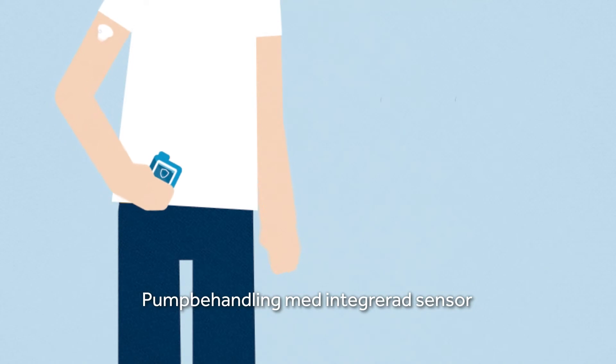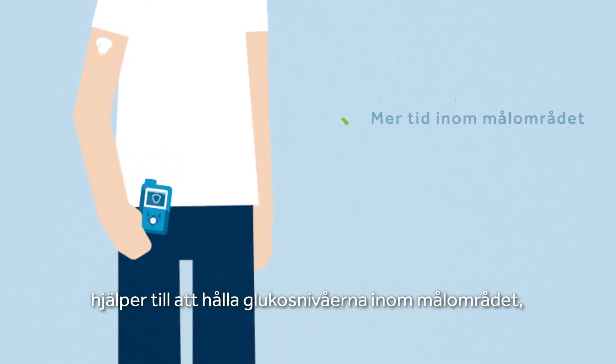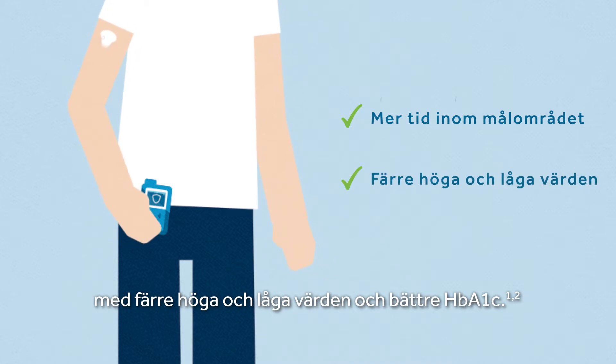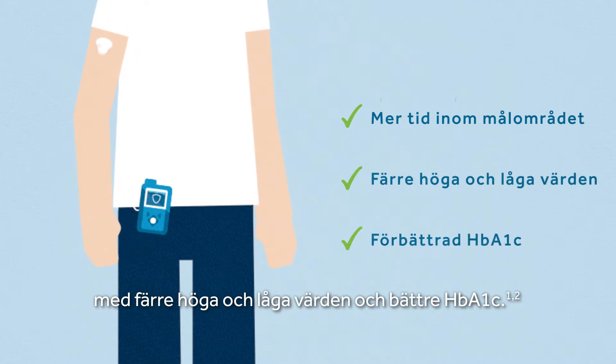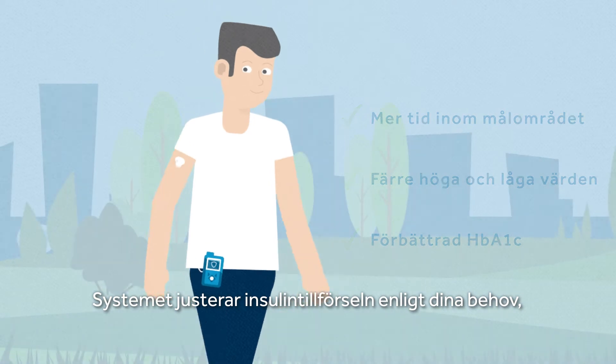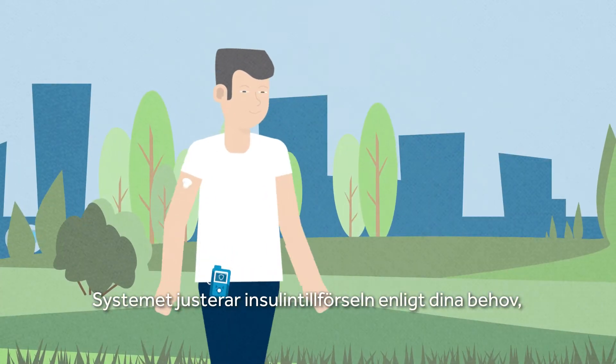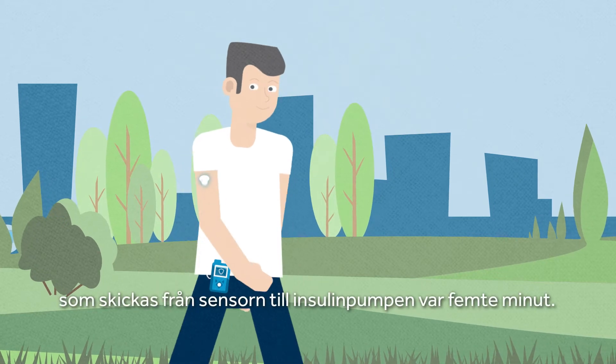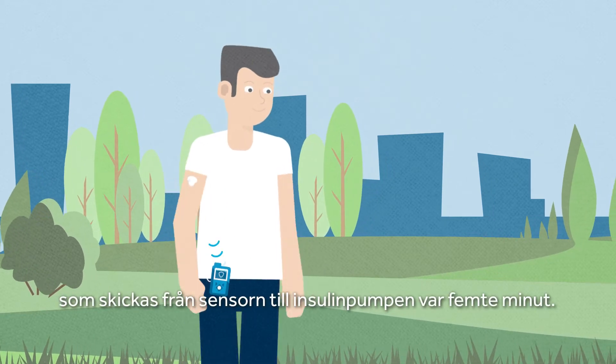Sensor Augmented Pump Therapy helps keep your glucose levels in range with fewer highs and lows and achieve better HbA1c control. It automatically adjusts insulin delivery to your needs based on continuous glucose monitoring readings sent from the sensor to an insulin pump every five minutes.